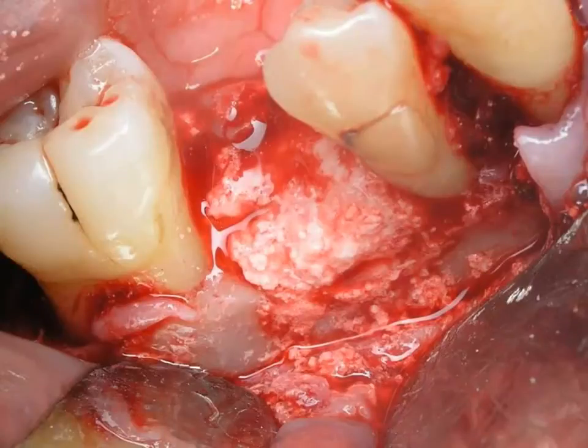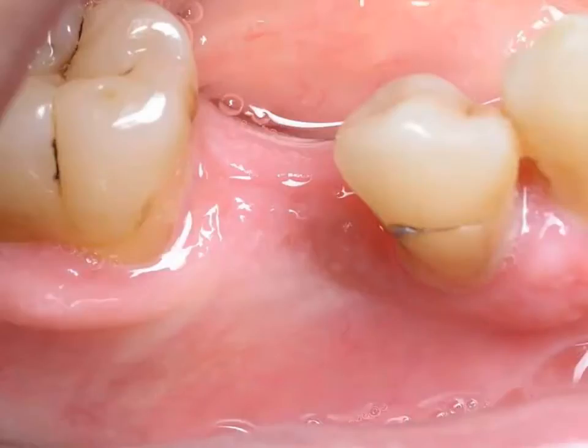BONDBOND absorbs blood post-implantation due to the hygroscopic nature of calcium sulfate. This has 2 advantages. The graft has hemostatic features. The blood inflow introduces growth factors into the microstructure of the graft. After 3 months, a complete healing and regeneration of both soft and hard tissues is obtained.